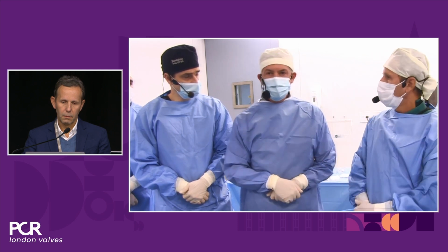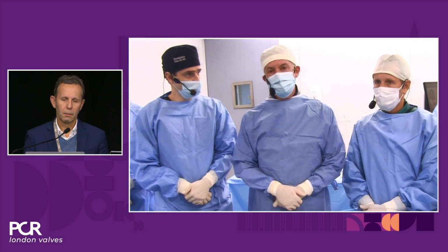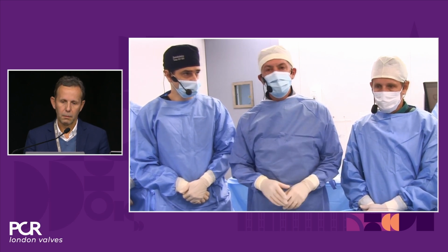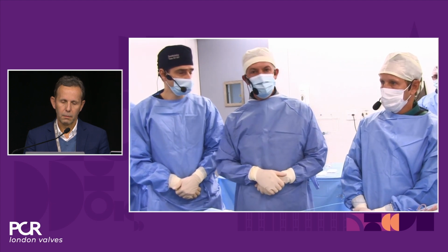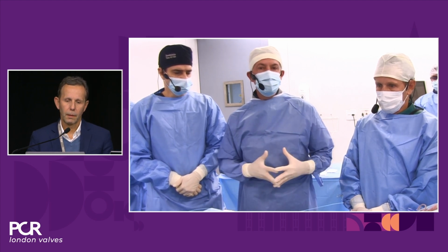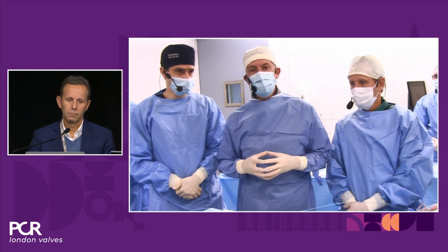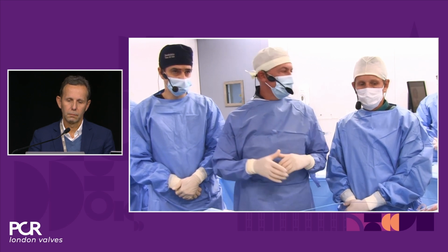Yes, exactly. So this is an investigation of the device in a very robust trial with more than 500 patients. The randomization is 1-to-1 against Sentinel, which is the current device approved here in Brazil and in many geographies around the world. So we want to see not only non-inferiority, but perhaps superiority, proving that we can capture more debris as opposed to the filter that goes to 2 vessels to the brain.